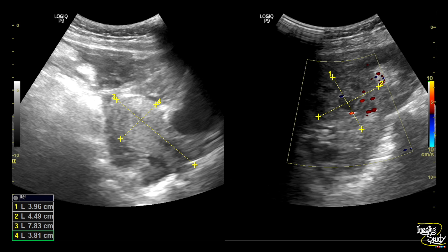Now let's see some pictures of this case. Here is the uterus in longitudinal section — it apparently looks normal. Adjacent to it you can see some heterogeneous hypoechoic areas, which are all hemorrhagic collection. Here you can see the partially filled urinary bladder and the complex mass with internal cystic area which we have identified as the ectopic pregnancy.